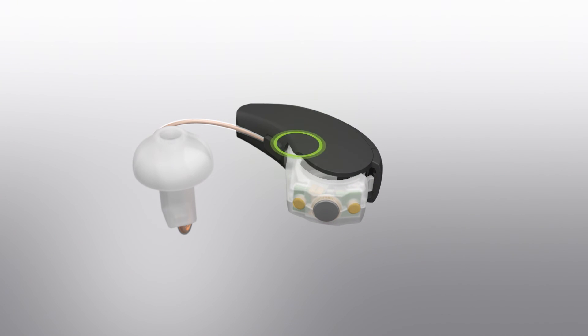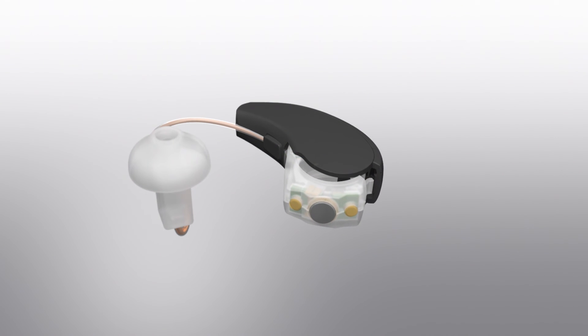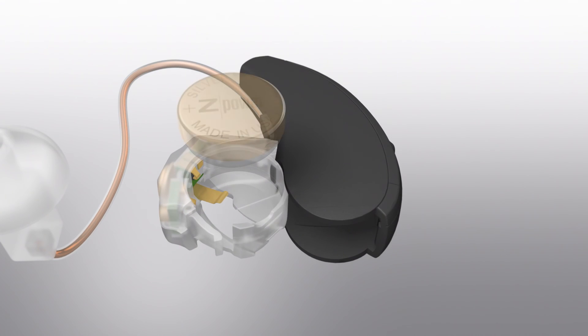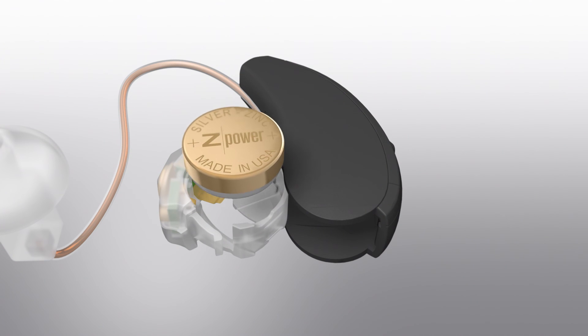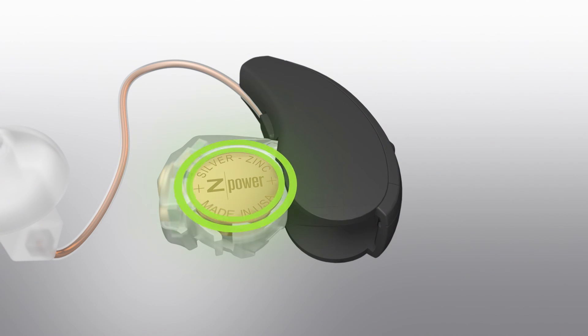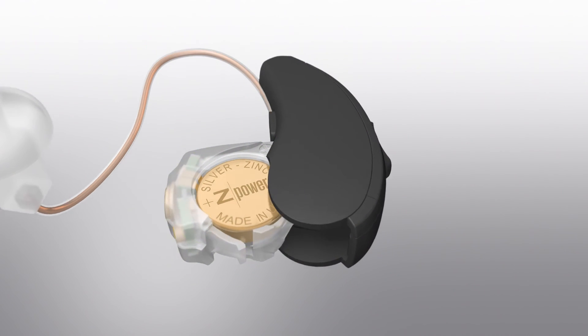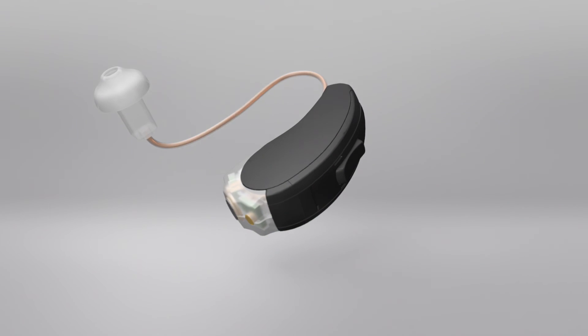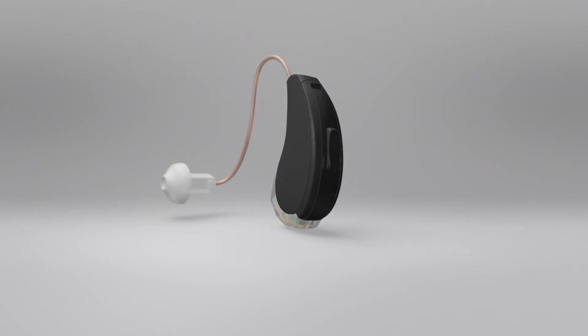Open the door. Insert the Z-Power silver zinc battery cell with our logo facing you or up. Close the door and present the new Z-Power rechargeable system to your patient.